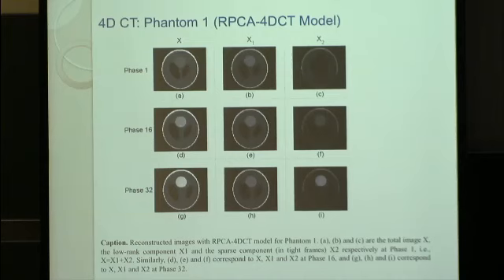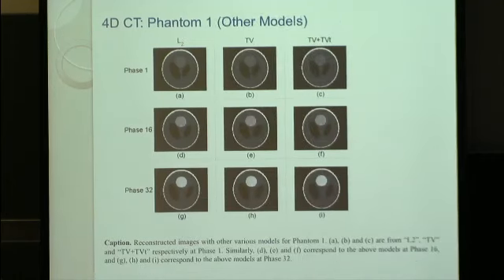The common part, because the motion is slow, many parts appear in many different phases. So that could be put into the common background. So this decomposition, although you know the background, you know the ground truth, this whole problem is ill-posed. You definitely see there's some motion of these two elliptic things, because this captures the differences between different phases. And you see the intensity change, and also you see little two dots due to the motion.